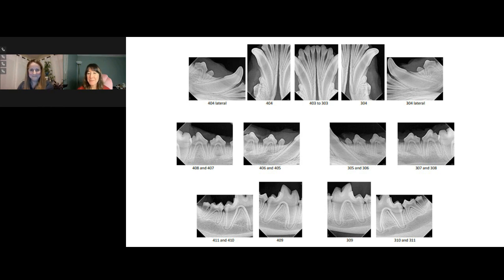We also have a few people who have asked why it's so important to take out unerupted teeth. And I'm going to expand that to ask, what about retained roots that don't seem to be causing any problem, but you notice they're there? Sure. Let's say you have an 11-year-old patient and you found an unerupted 305 and there is absolutely no evidence of a widening at the crown of that tooth, and these are people who are going to come back to you for monitoring. You're probably going to be fine to monitor that.